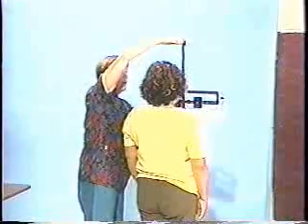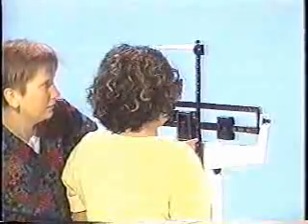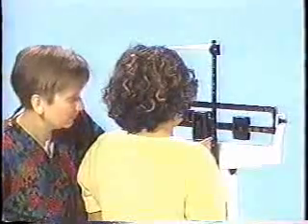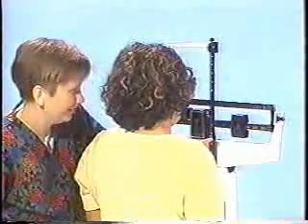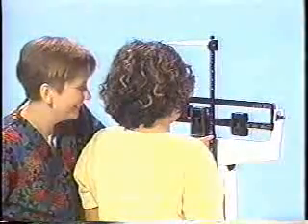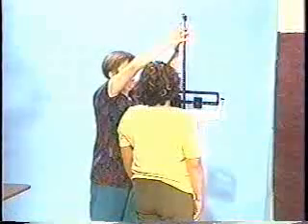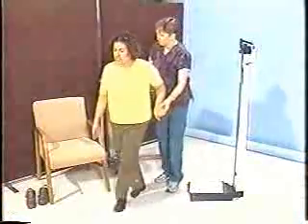Adjust the height bar on the scale to rest on the patient's head. Read the number at the movable part of the ruler section. Convert the total inches to feet and inches. Assist the patient off the scale.